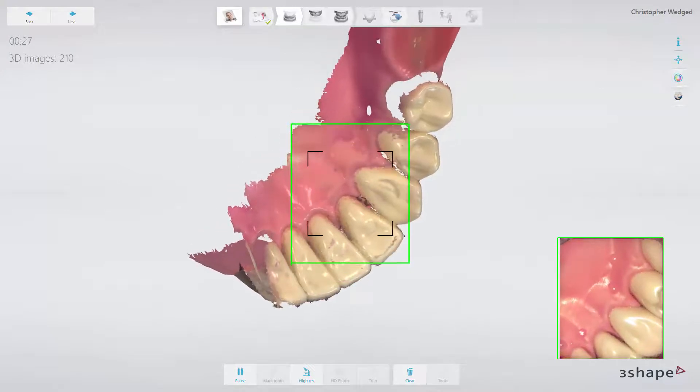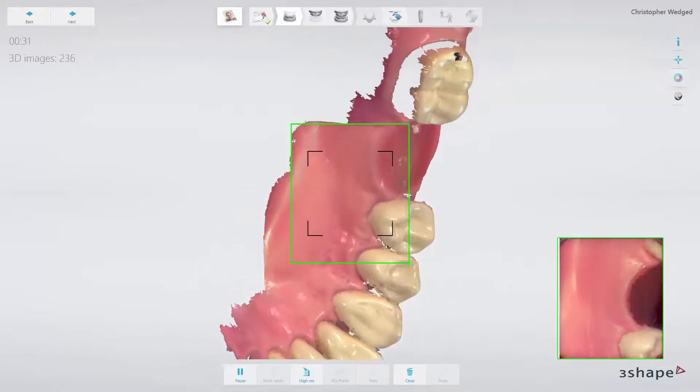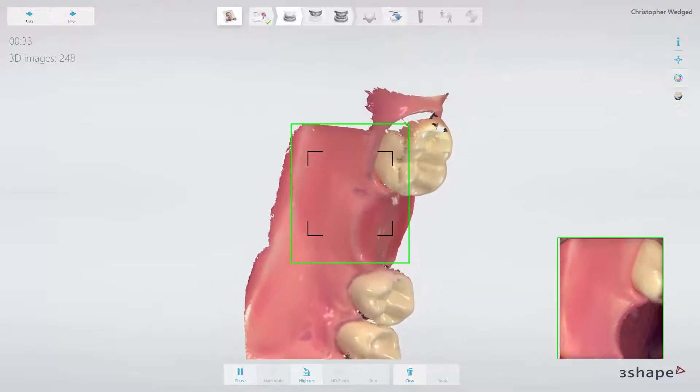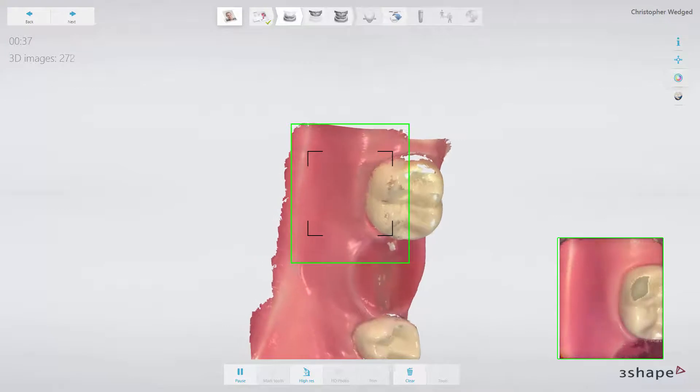When turning lingual, try to go as deep as possible, using the tip to push the tongue aside. If possible, use a 70 to 80 degree angle, so that the scanner can grab images of the whole crest.